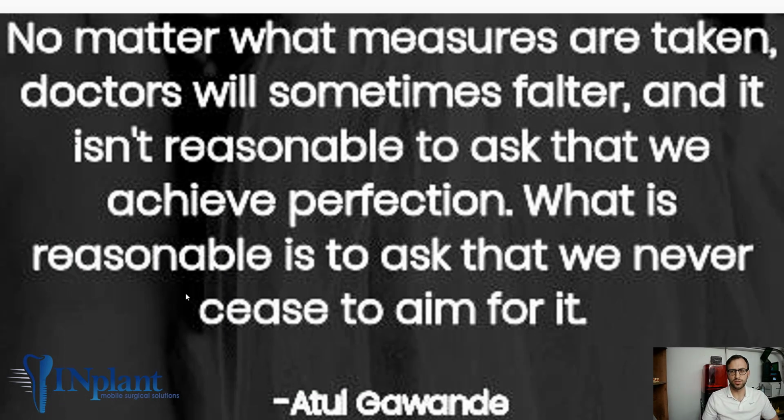One of the things I like most about this case is that it didn't go perfectly. It was a challenging case, we all knew that, but we were able to get it done. So again, we know that there are going to be complications along the way. I think we all learn more from complications than when things go absolutely perfectly right. So let's get into it.